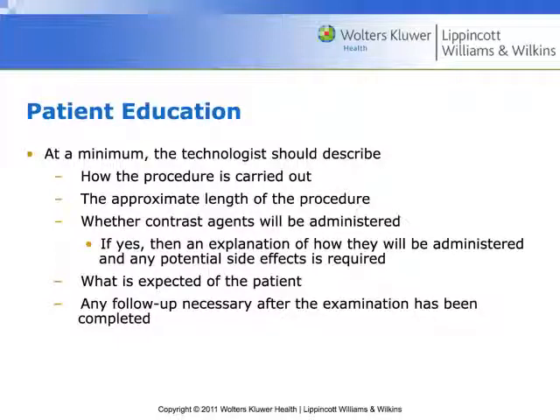Whether or not we're going to be doing contrast, we are going to be doing contrast today. We're not going to be doing contrast today. Contrast is just stuff that helps us see your insides more clearly. And what I need from the patient, I need you to really hold still. Let me know if anything's hurting. Let me know if all of a sudden you can't breathe, but otherwise hold still, right?